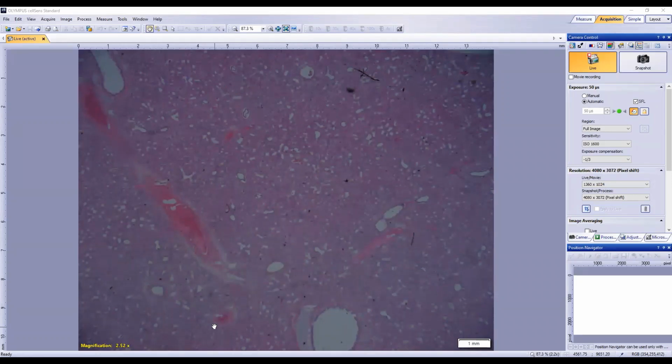Being an abscess, it's going to be mainly neutrophils in the middle and a lot of necrosis and cell death, so a lot of pink stuff at low power, I guess. Yeah. And then depending how long-standing it's been, you may get some more organisation around the edge, some more macrophages, some fibrous tissue, and a bit more structure to it around the edges.